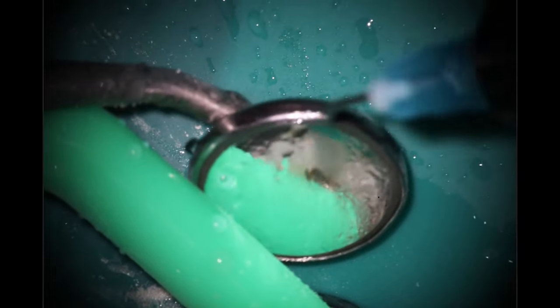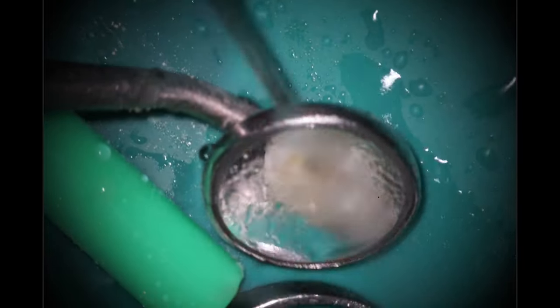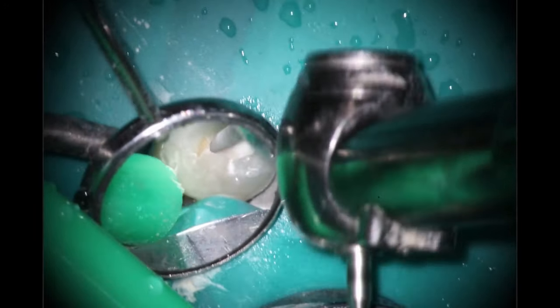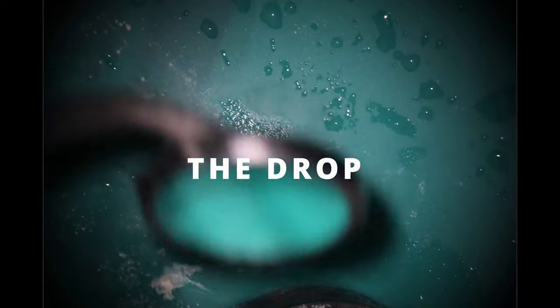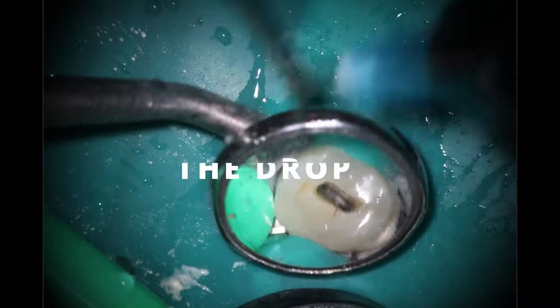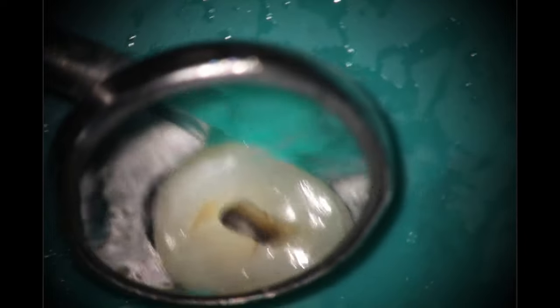The 850 is pretty much the one bur I use on every single case. It's really skinny — it's at 0.14 — so it doesn't create a large access shape and we're still being nice and conservative. I can use it for troughing for MB2s, we can use it to prep teeth — it's a very versatile bur and one of my absolute favorites. Going ahead and dropping down — in this case I actually got a drop right into the actual chamber, which is always fun. We have two canals, buccal and lingual.